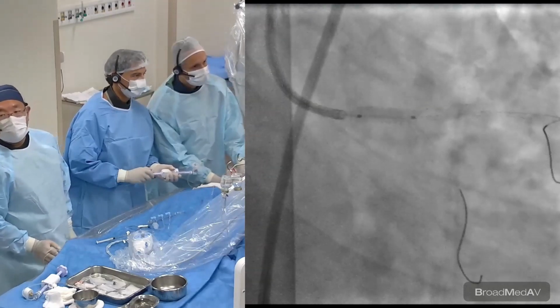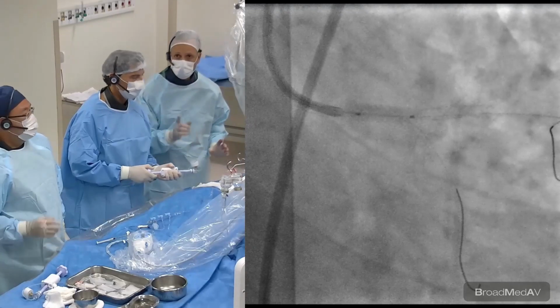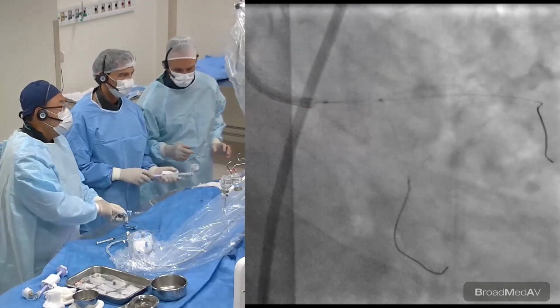That's a teaching point. It's very important. Do you think it's in a good position? Good position. Now we're going up. 4.5. Again, you went up to... Can you go up, Rodolfo? Go up. How much? 15. Go up.